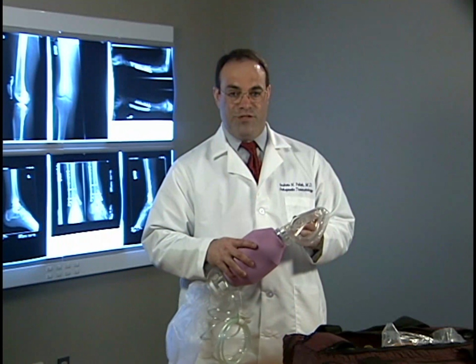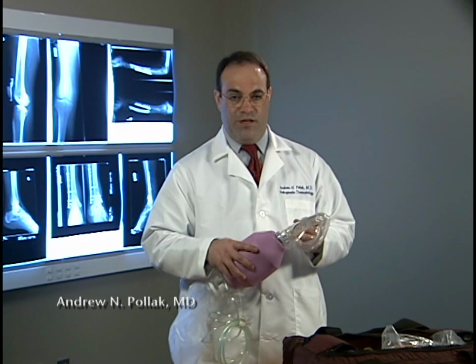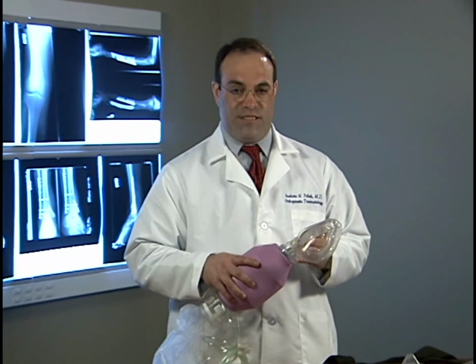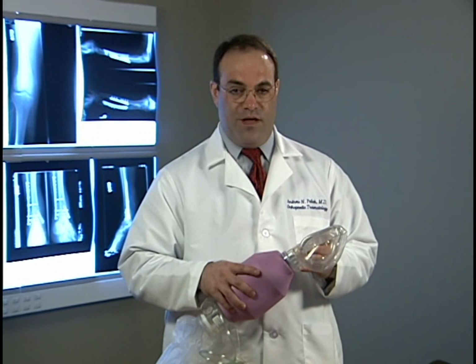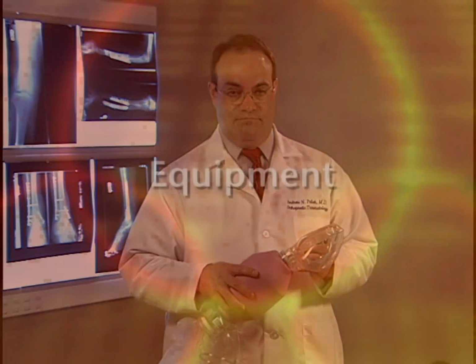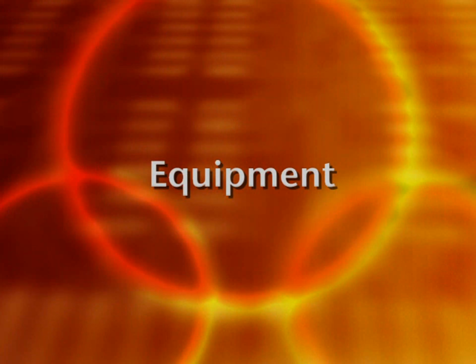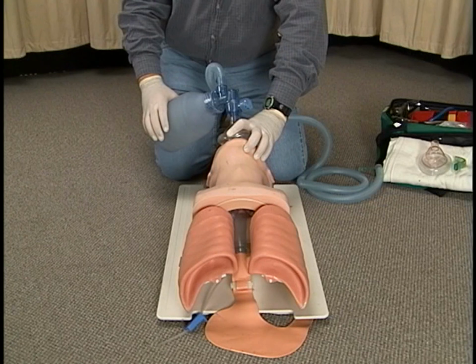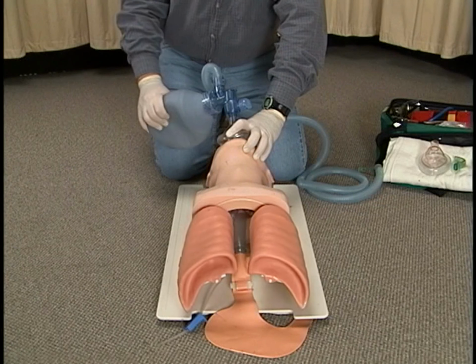Any apneic patient needs to receive effective ventilation with a BVM and supplemental oxygen. Maintaining a good mask seal and providing proper ventilatory volume and rate are necessary to be successful at this station. Candidates at this station will have the equipment, supplies, and additional personnel necessary to effectively ventilate an apneic patient.